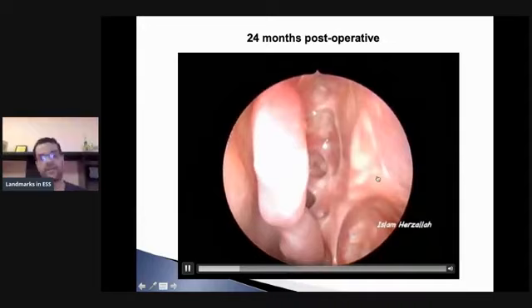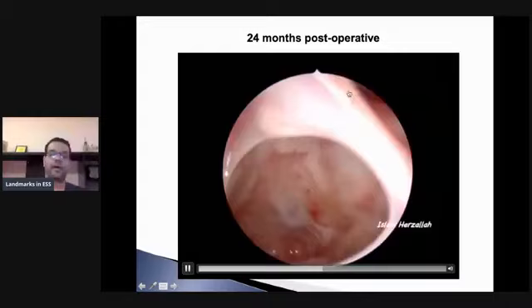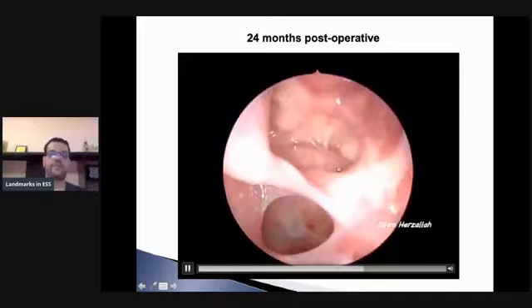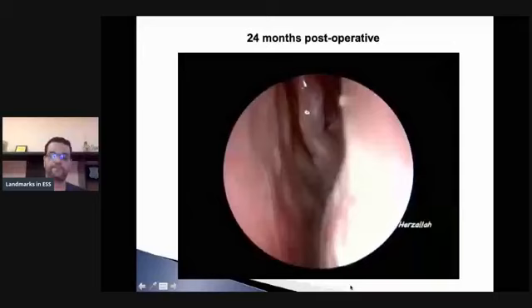And you see the remaining part of the superior turbinate and the sphenoid sinus opening right there, posterior ethmoid roof. See, this is the sphenoid sinus, obviously, that's the ICA. And this is the posterior ethmoid roof. That's the posterior ethmoid artery. You see as well all the way we are going to the frontal recess region. And that's the area of the maxillary sinus.